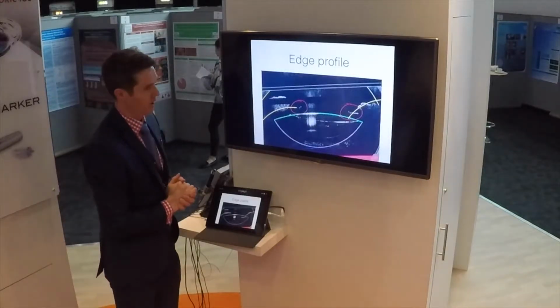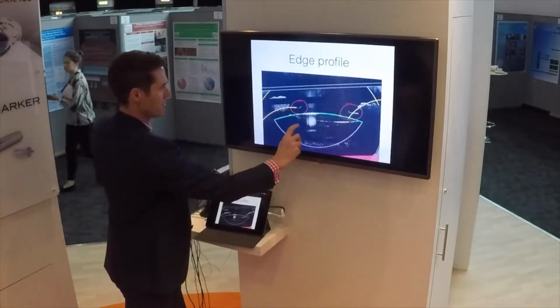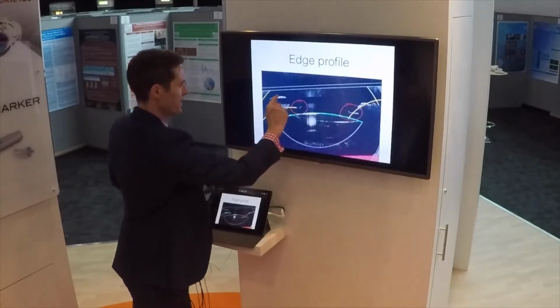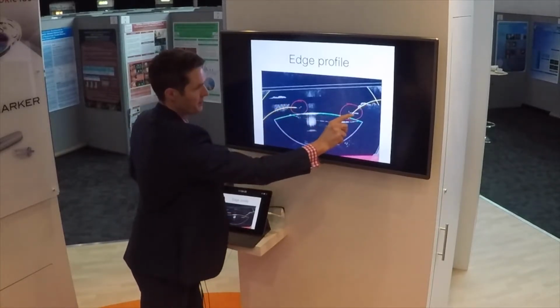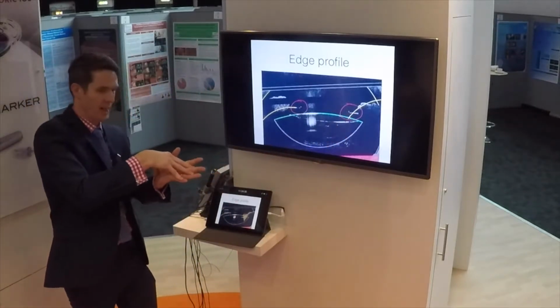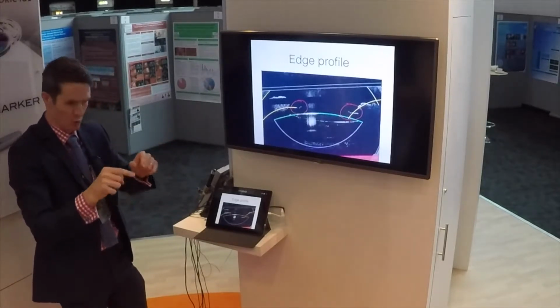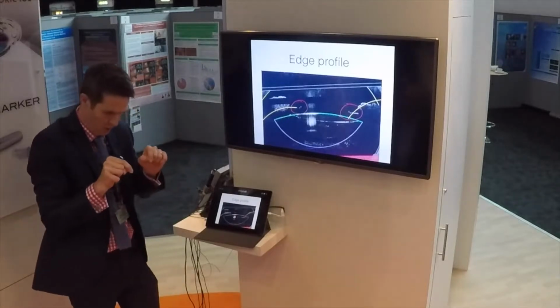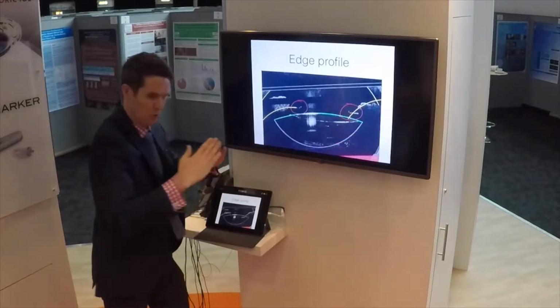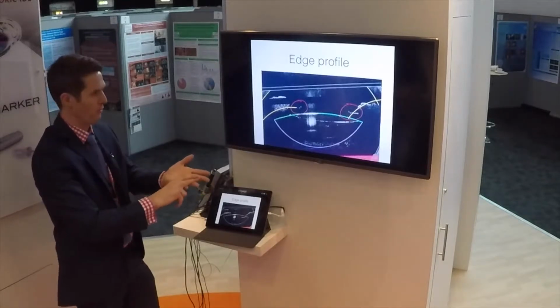If you look at the edge profile, this is on an OCT. You can see that this is the lens, this is the anterior capsule just here, this is the iris edge here. Now the red circles are demonstrating this effect that I mentioned before. When the Zepto attaches to the anterior capsule, when the pulse goes around the nitinol ring and you get the cleavage of the anterior capsule, you get coagulation of the proteins in the capsule, and then the distal capsule curls slightly forward, which gives it an extra strength that you don't get with manual and with femtosecond laser.